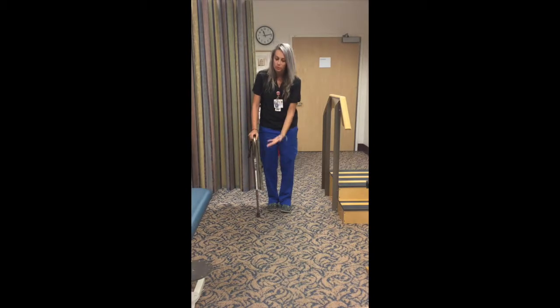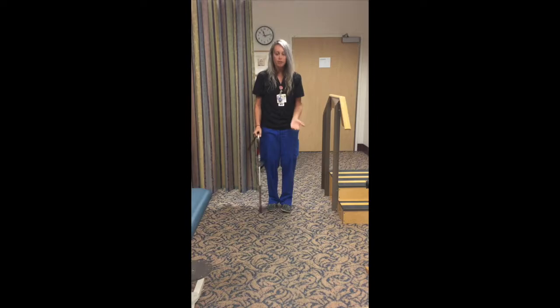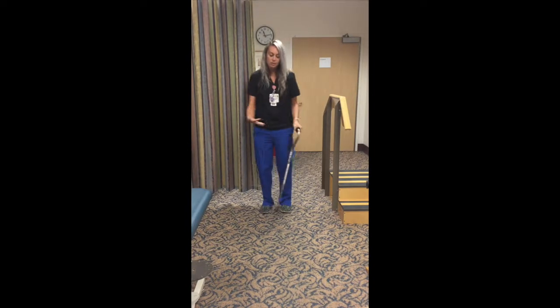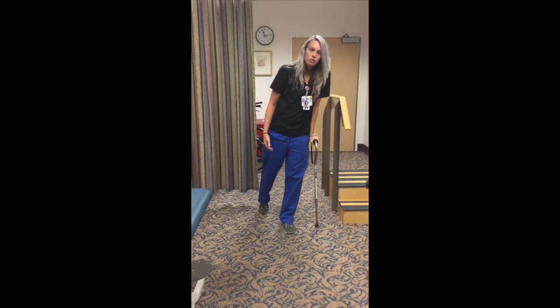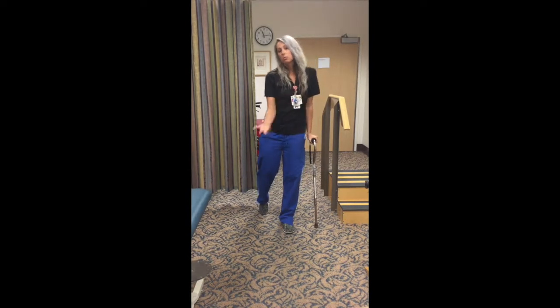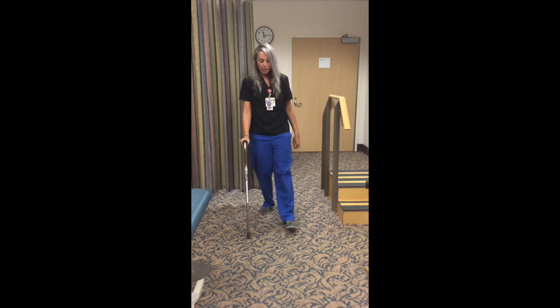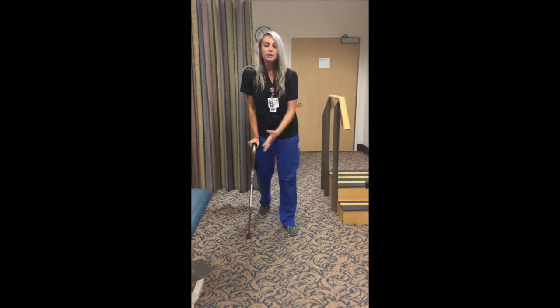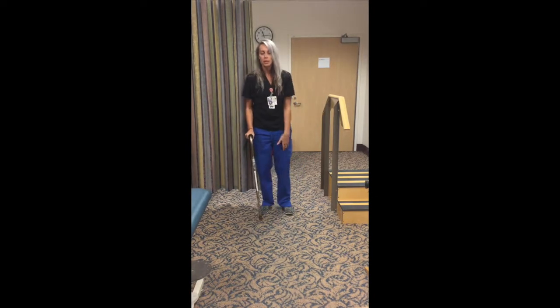Again, since you have a new joint, everything's in a new anatomical alignment, and we want it to be correct. The other thing about that is if this is your painful side, you're actually leaning towards your painful side if you're putting the cane on that side for support. That then becomes more of a crutch. You're hurting yourself more by doing it that way. So putting the cane on the opposite side gives you a chance to take some of the weight away from that side so that you're not pushing more towards it, and you're promoting correct anatomical walking.